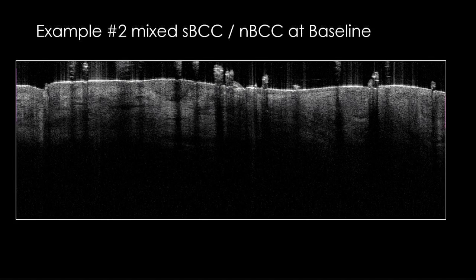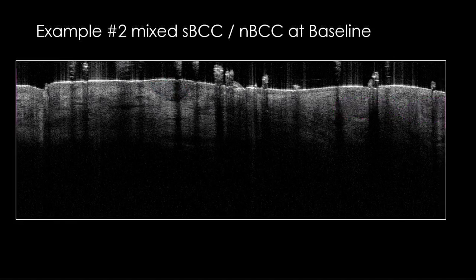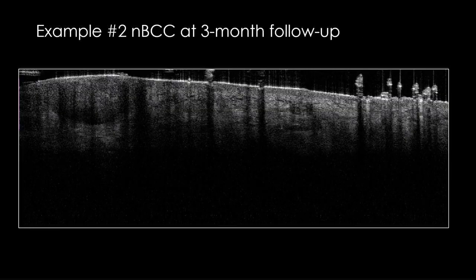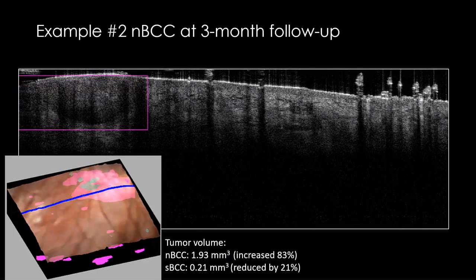This scan was a little bit more demanding because of the presence of hairs causing shadows, but we were impressed that it actually found the tumors quite successfully. And in this particular case, the tumor actually grew, and we were able to measure that as well.